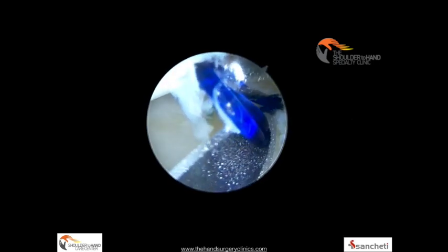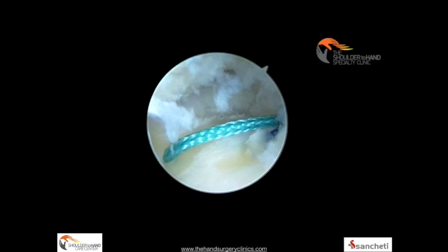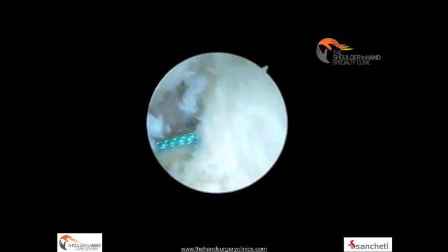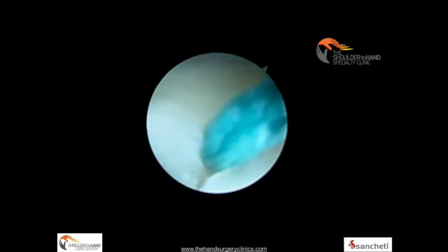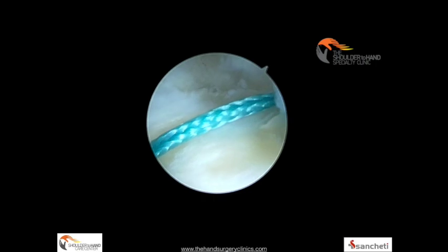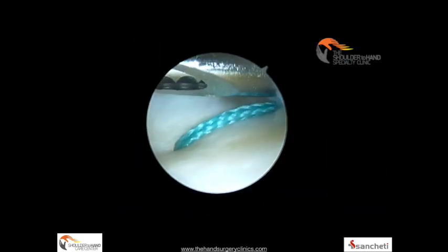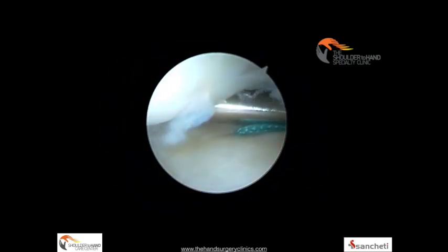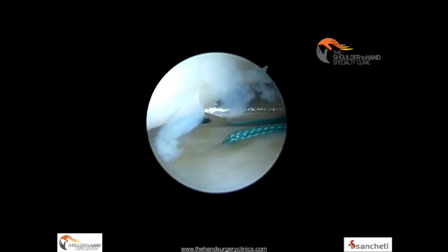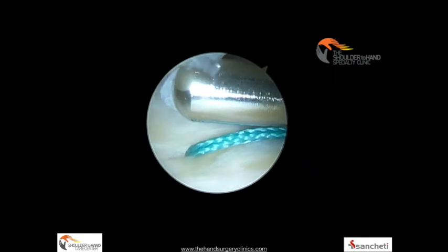In this particular case the TFCC structure looks good, so a simple horizontal mattress suture is sufficient for repair; however, a Mason-Allen type stitch can be used if the TFCC appears degenerated or flimsy. As seen here, the Ethibond suture is retrieved and the suction test is performed again — the TFCC does not get sucked in as much, demonstrating that even prior to tying the suture knot, holding the TFCC in place shows a nice solid repair can be achieved.